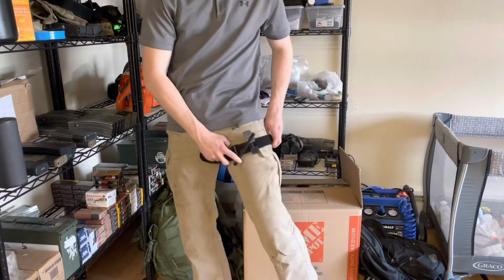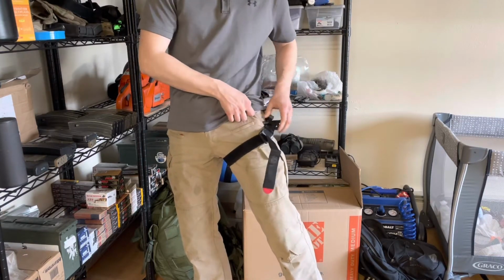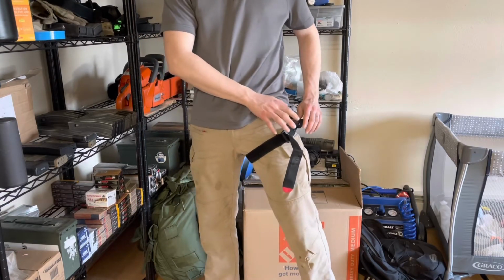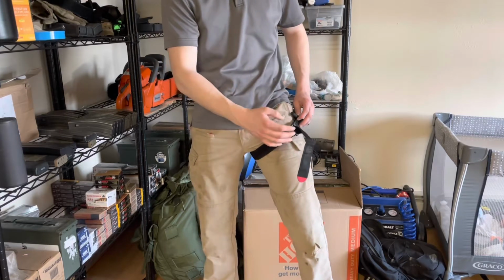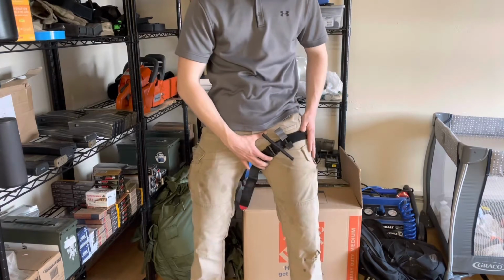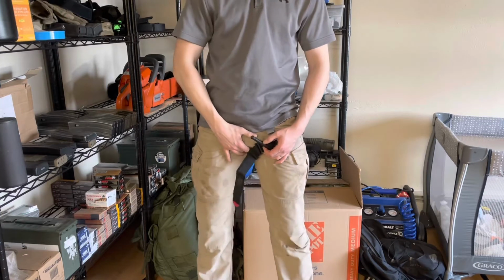You don't want to have it somewhere like right next to a pocket or something where you're going to get caught in your pocket when you're trying to spin it. That's gonna catch you and just cause you to take more time to put the tourniquet on unnecessarily. If you're doing a self-application, I like it right here in front where there's no pockets or anything really to get snug into, and you really only have to worry about outer garments or the crotch area of the pant.